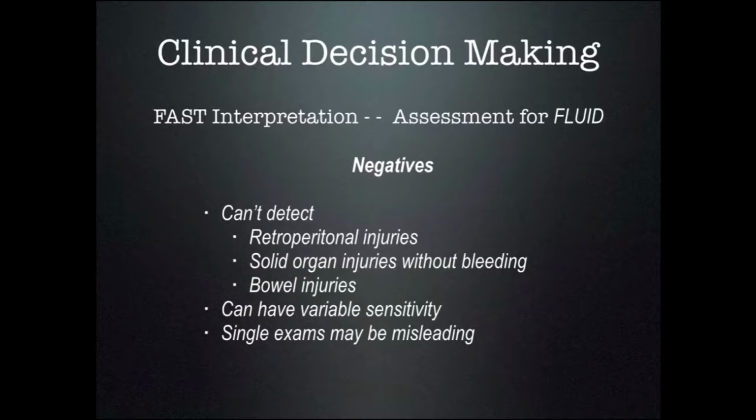And single exams may be misleading. So you may have an initial exam with a sensitivity of 31% and miss the diagnosis. So you should always avoid doing a single FAST exam. You should either do serial FAST exams or a FAST exam and a CT scan.